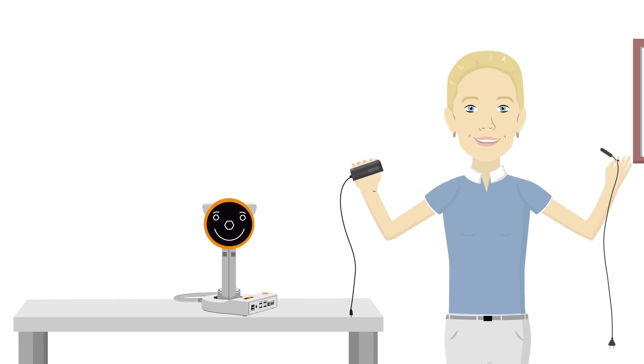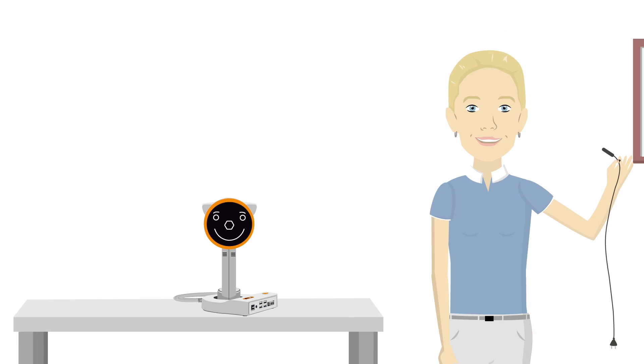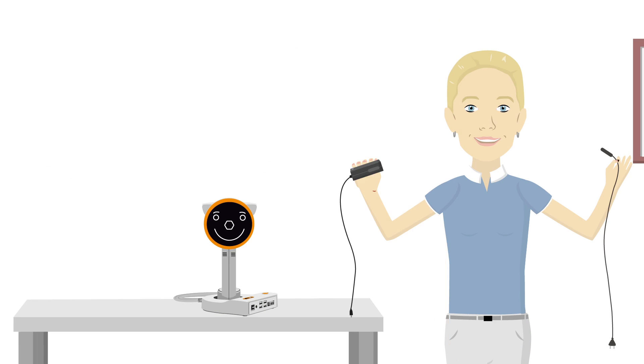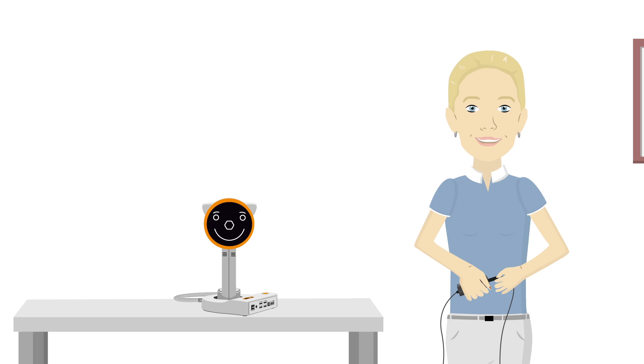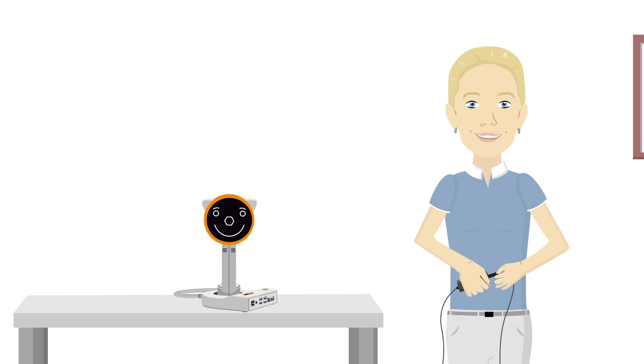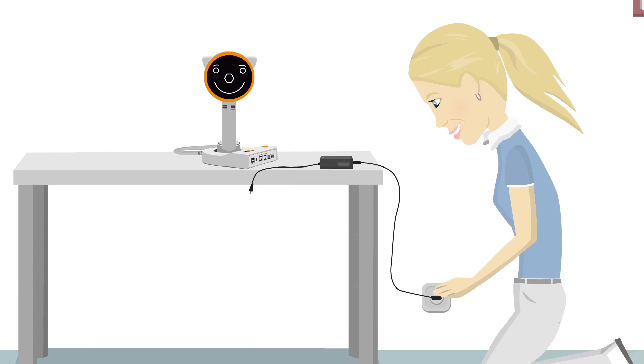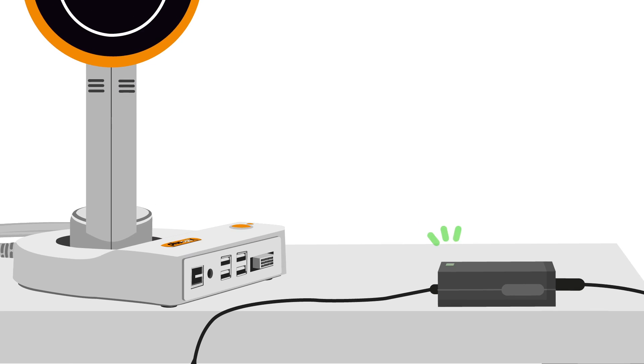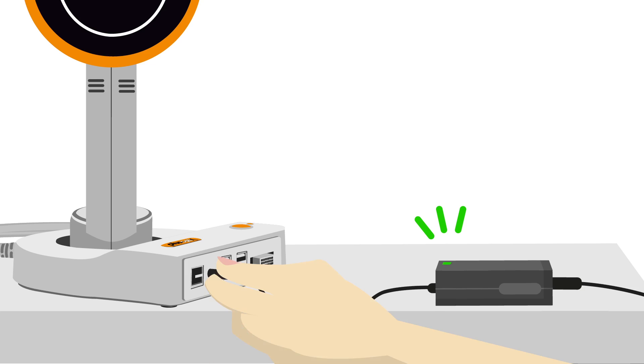It's time for Anna to connect the power supply. Find the power supply and the included power cord. Connect the power cord to the power supply and plug the power cord into an electrical outlet. Look for the green light. The light indicates that the power supply is working correctly. Plug the power supply into the device 12V power supply connector.